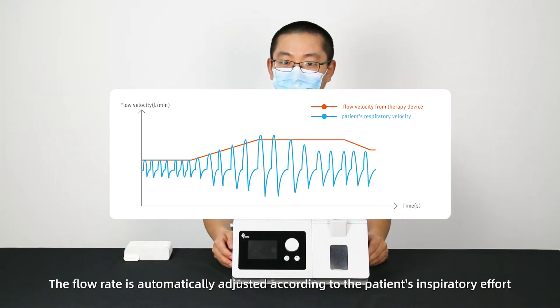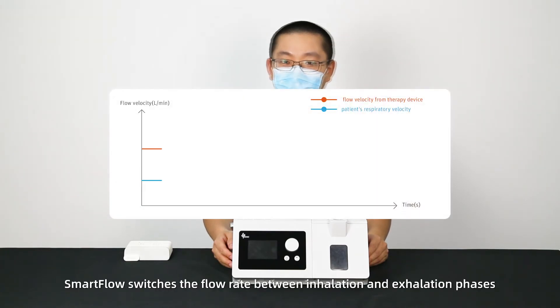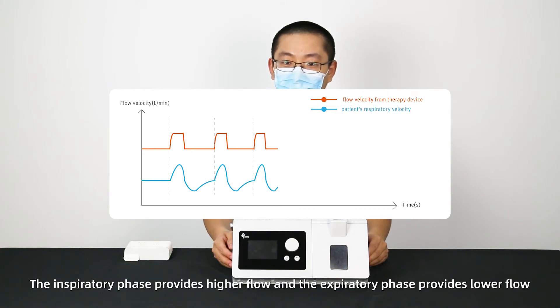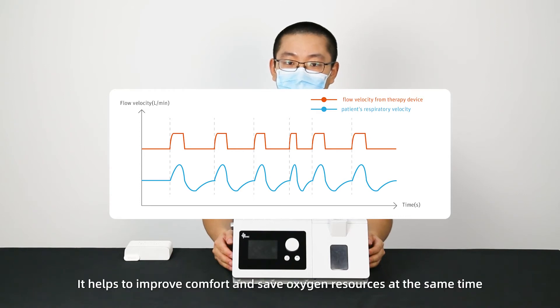Smart flow switches the flow rate between inhalation and exhalation phases. The inspiratory phase provides higher flow and the expiratory phase provides lower flow. It helps to improve comfort and save oxygen resources at the same time.